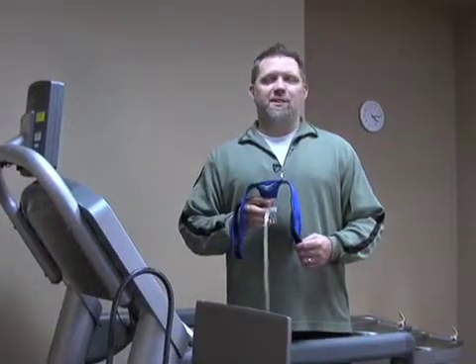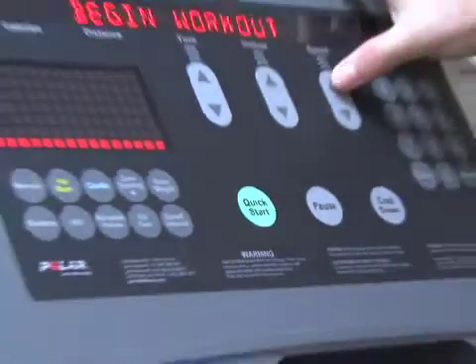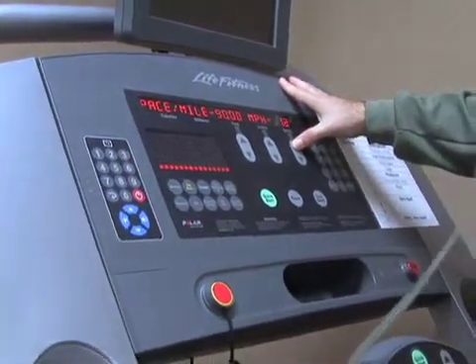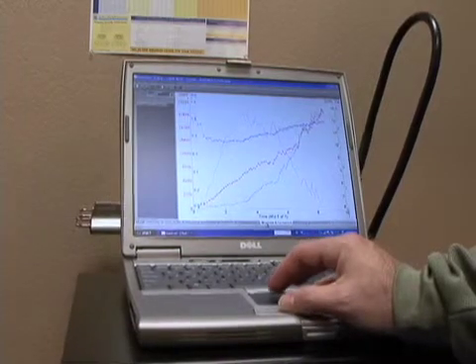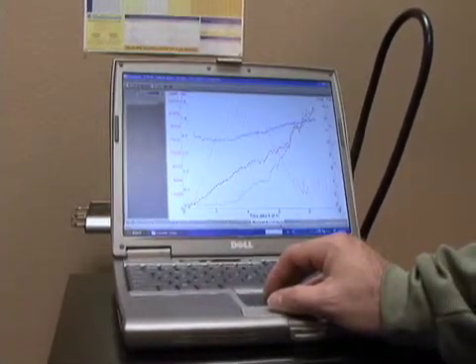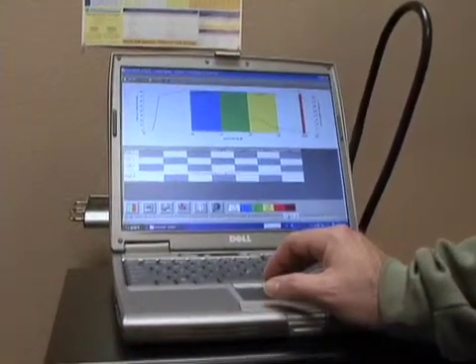On average, this test takes just about 10 minutes. Once we get you prepped for the test, we're going to put the mask on. Once you step on the treadmill, we'll hit quick start, and we'll start off at a very low intensity — just a couple miles an hour starting off. Throughout the test, we're going to be monitoring your progress. Generally what happens is we start off at a low intensity, gradually increasing that about every minute. First we start with a slow increase in your speed, and then gradually increase the incline.